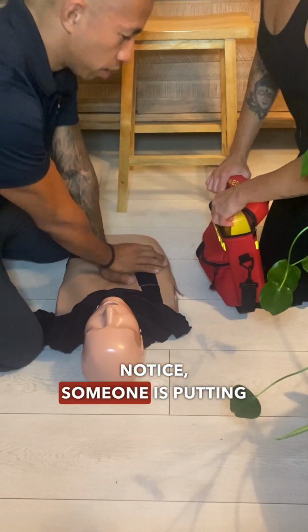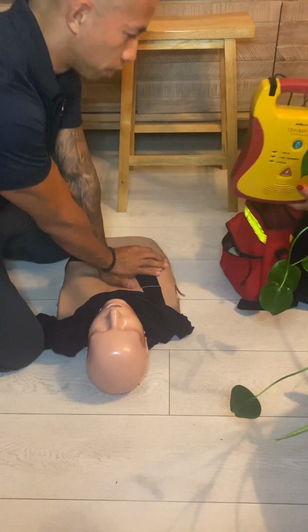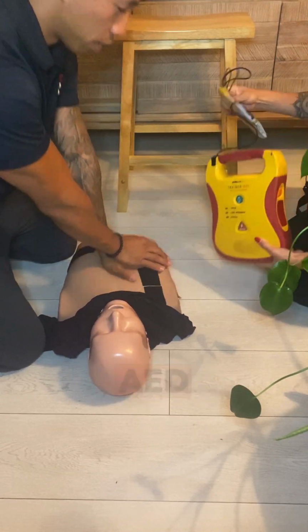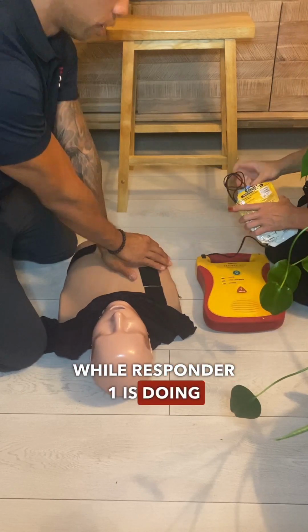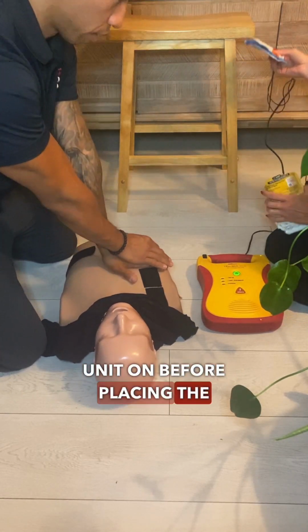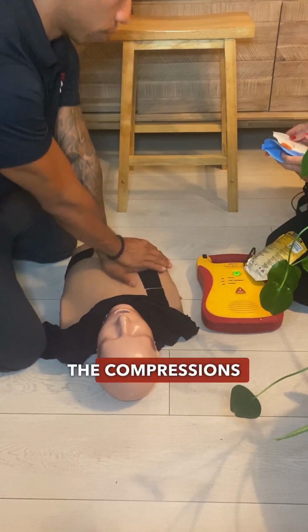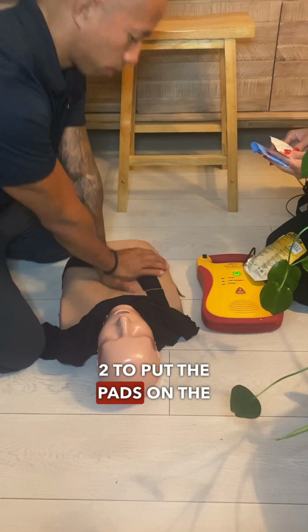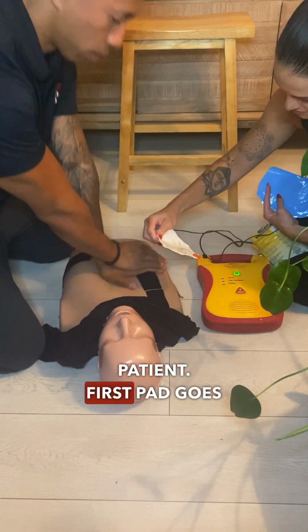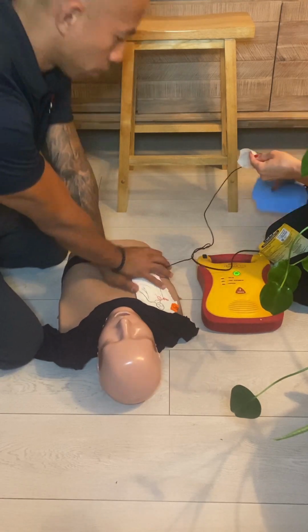Notice, someone is putting on the AED the entire time CPR is being performed. Responder 2 is placing the AED while responder 1 is doing CPR the entire time. Turn the AED unit on before placing the pads on the patient. Notice responder 1 does not stop compressions for responder 2 to put the pads on the patient. First pad goes top right, second pad goes bottom left.